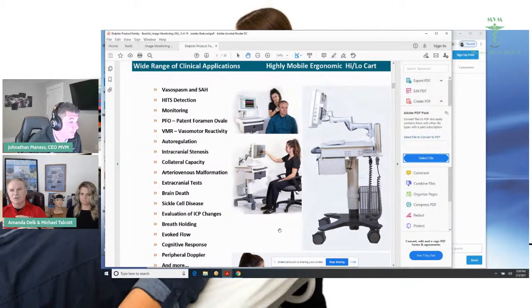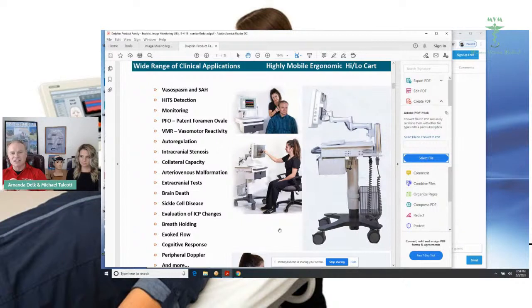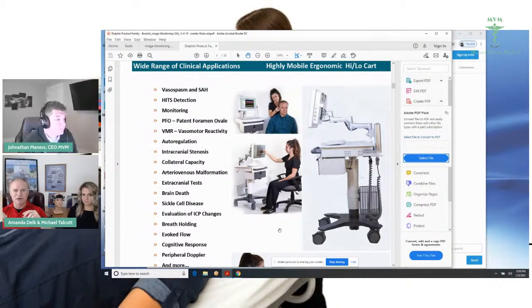Exactly. That's one of the things that we are constantly trying to update people on, is that this can be a quick diagnosis for you. You can walk in and literally 30 minutes later know that, hey, my dizzy spells are caused because I have a couple of carotid stenoses that combined are causing me not to have enough circulation in my cranium. Or if you have a patient that, they're exercising, they just get winded quickly and they get dizzy. Well, why is that? Well, PFO. It's easy to diagnose. You may wish to have it treated, sealed up, or if it's a small one, you just maybe have pharmacological treatment. But it is quick and easy.